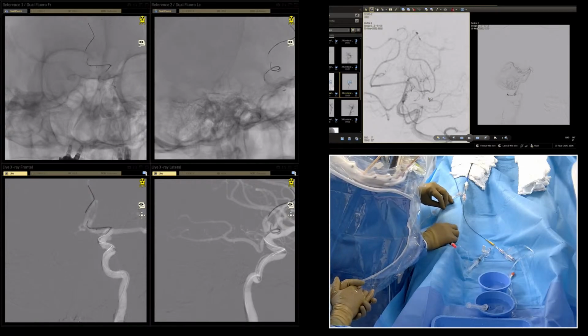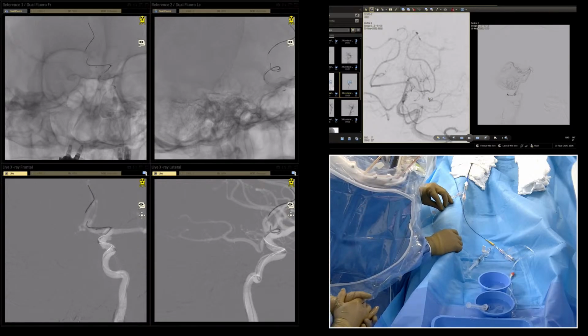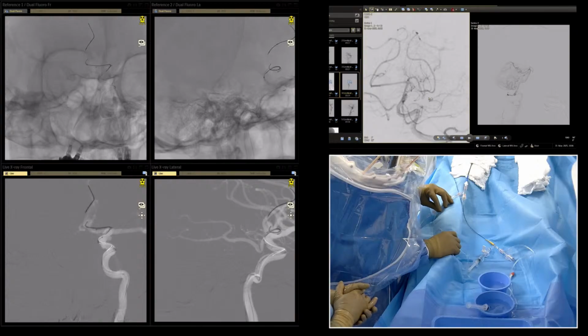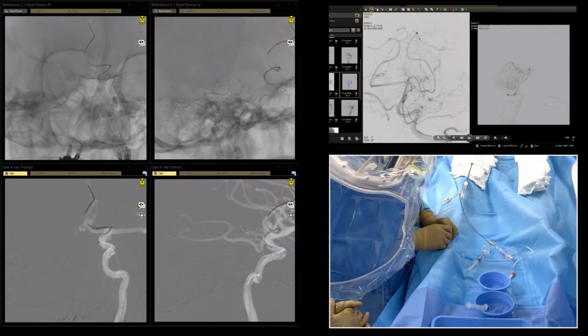I think the Headway, the Gamma is quite stiff. Let's rotate. Something is possible to rotate. It's more stable, but again, this anatomy. Okay, let's see.